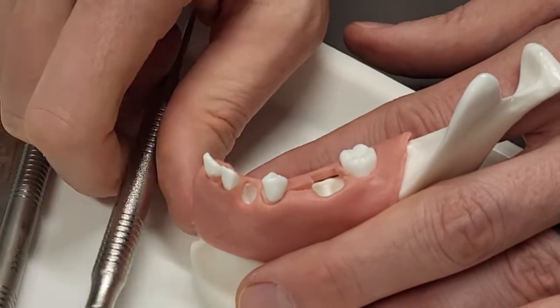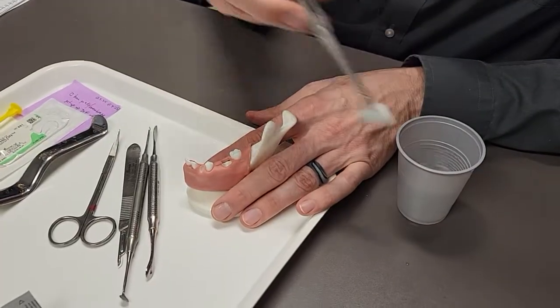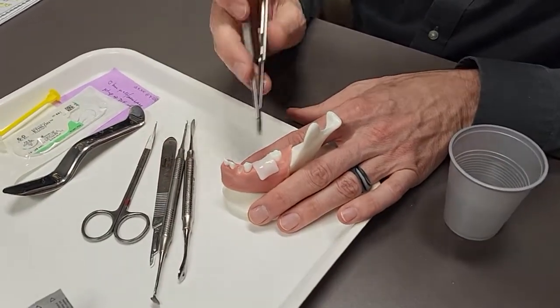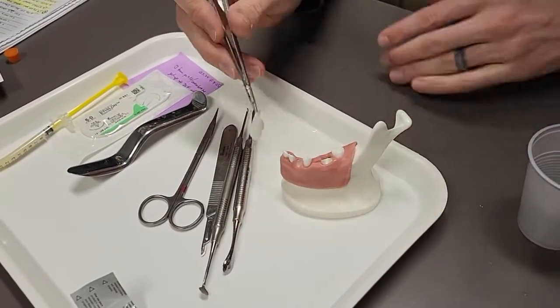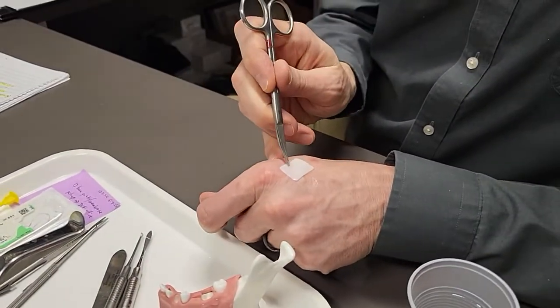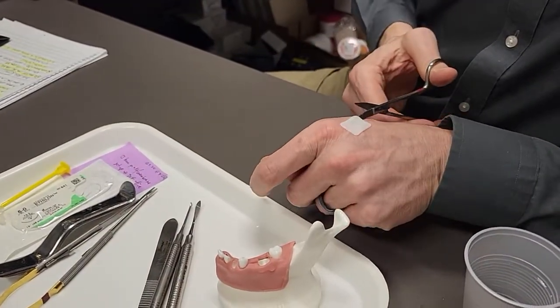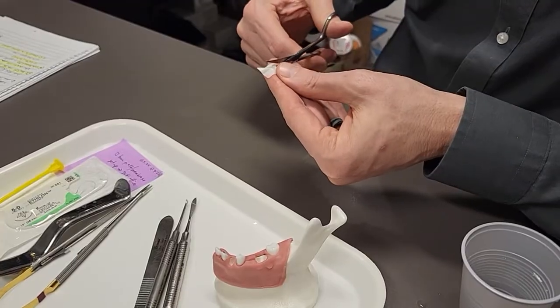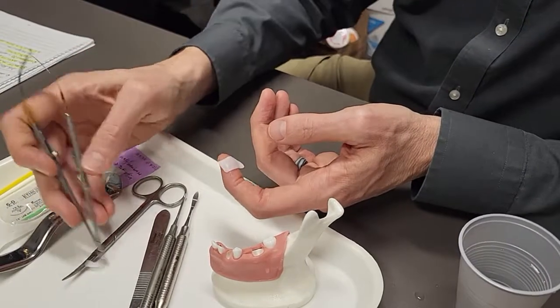Then we're all ready to go. We're ready to do the bone graft. We get out our little dude here — normally I'd have some forceps — and then we lay it over the top and see how nice and flexible that is, super flexible. In this case, I'm going to pretend that there's a tooth right here. It's too wide to go through there, so we're just going to cut across about the thickness of the area. Some people go fancy and they'll do an hourglass shape, and that does create more grip across those areas — I don't know if that's necessary, so it's up to you. If you want to be fancy you could do that, but otherwise you just want to cut it straight of the thickness. You can touch it with your gloves — it's fine. You just want to make sure it's a clean surface; I'll dip it back in the water, make sure it's nice and cleaned off.